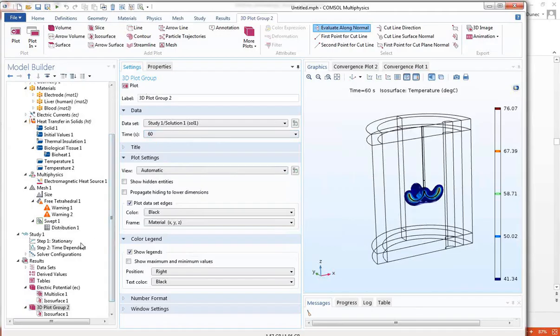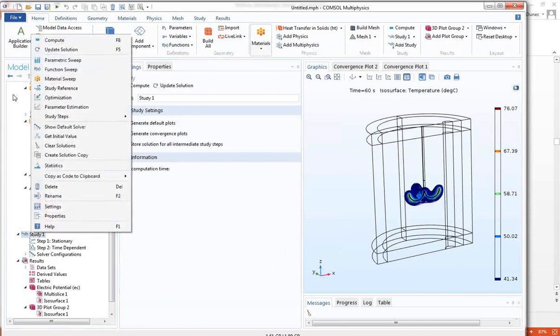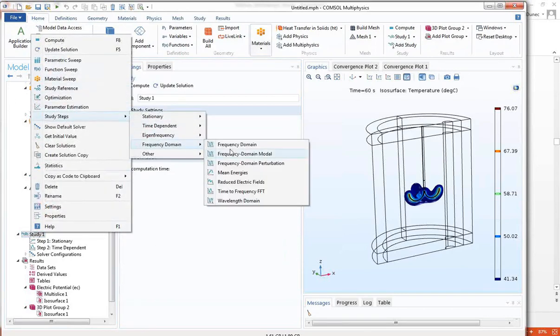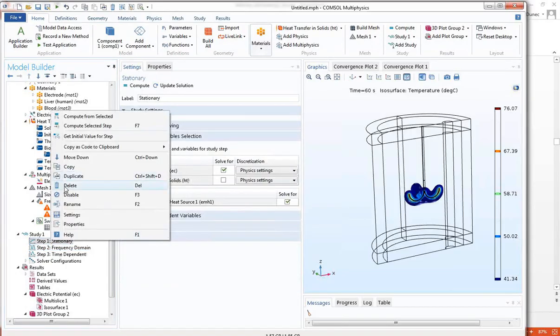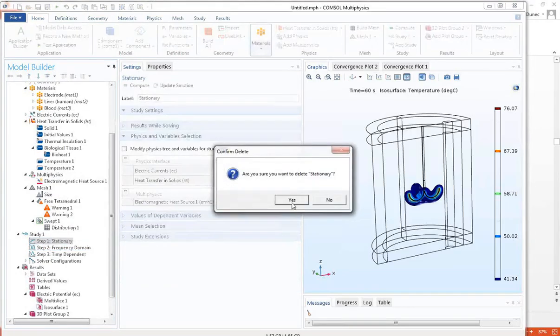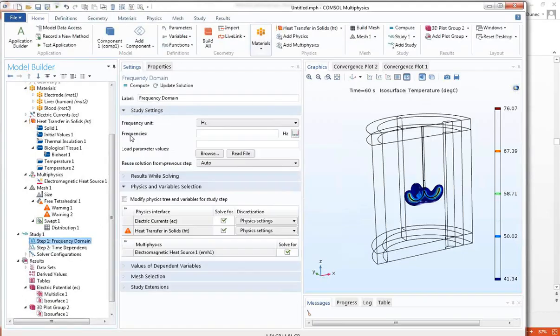Now how would I change this to a frequency dependent study? Trivial. Right click on study and go to study steps. I'm literally just going to go to frequency domain and add it. I'll drag it up where the other one used to be and get rid of the stationary one. Then I'm going to set it in kilohertz, and we'll do it for 1.2 kilohertz. Trivial. This is pretty easy.